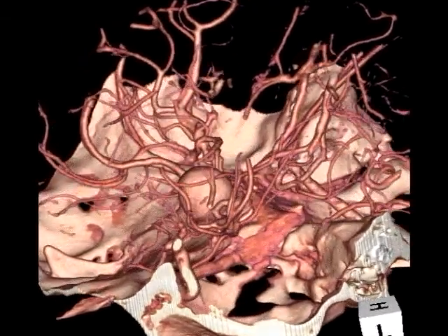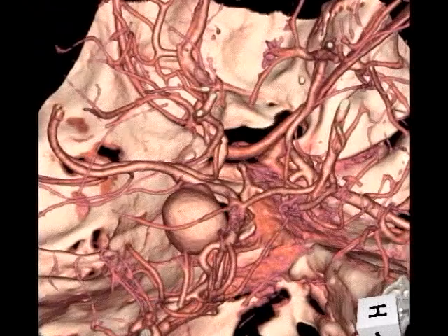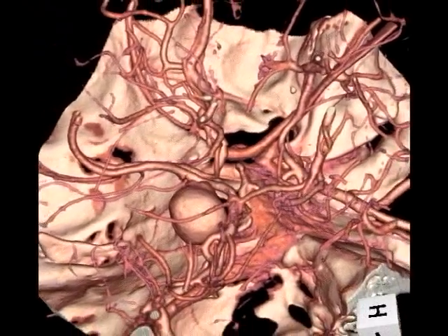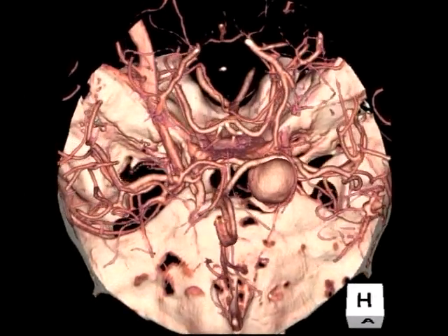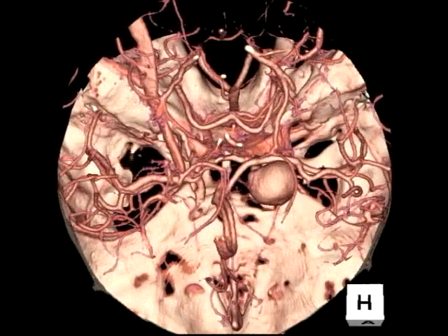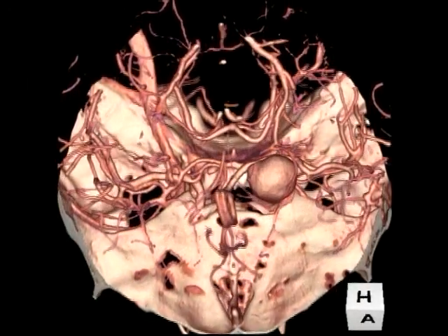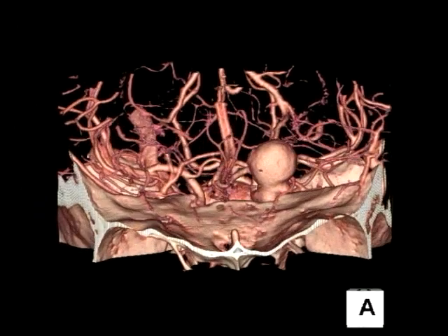The image is distortion-free, viewed from any direction. The bleb of an aneurysm is clearly defined. Not only the AICA and the PICA, but also its thick, penetrating branches are depicted. This image, too, was reconstructed from isotropic data acquired using a thin ½ millimeter slice.